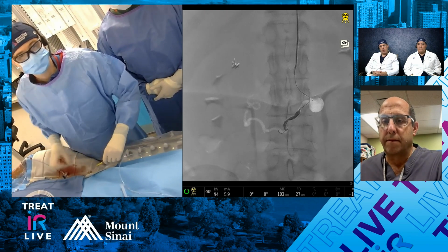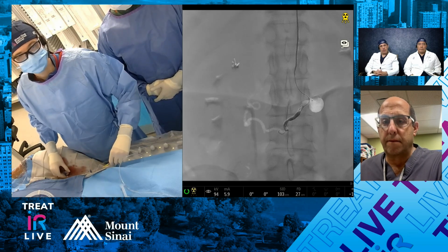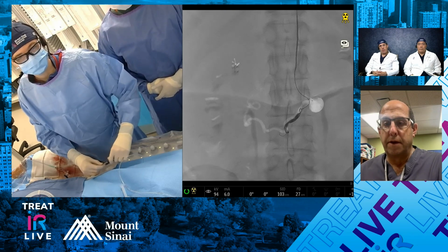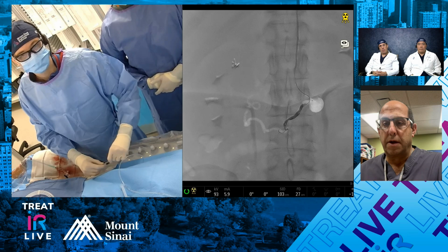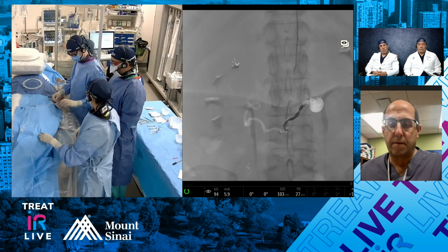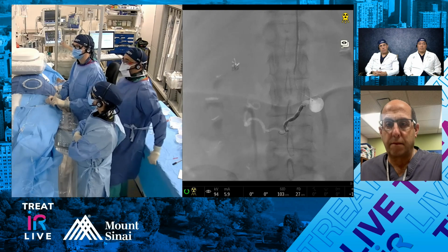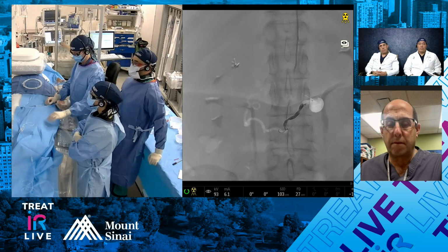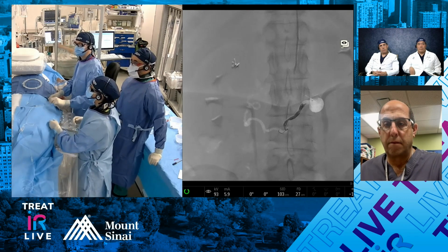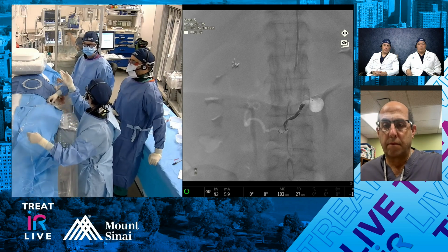I think, Tim, you measured this and you said this was the same size as the native aorta, correct? Yes. It's actually slightly bigger. Yeah, this one's slightly bigger than the aorta. And so the other thing that also factors into her decision, she's not really a transplant patient quite yet, but she is going to possibly need a transplant later on. So obviously that would also add to the risk. She's thrombocytopenic. It's 70 right now, but not too bad. But that also figures into her decision.